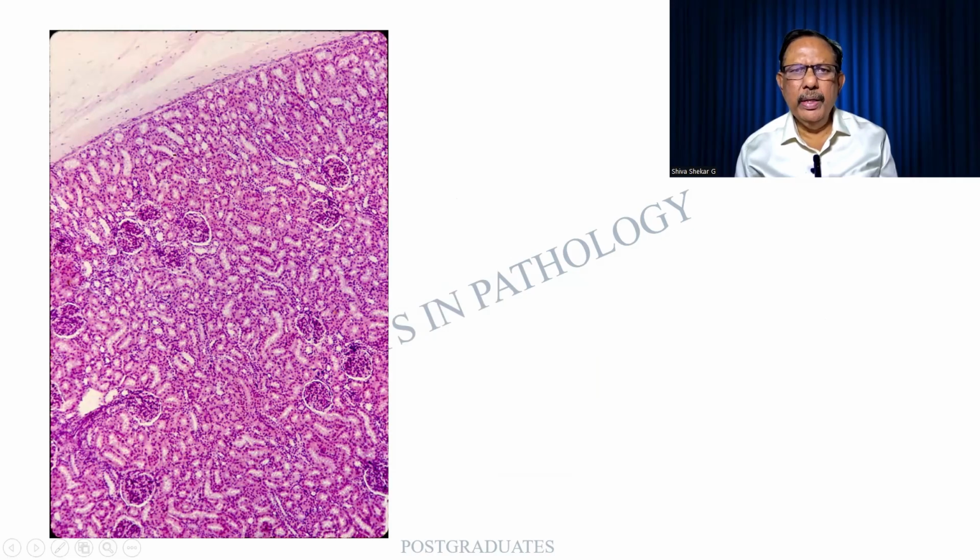You people should be familiar with it in order to explain to your students and also to understand the nuances of the renal pathology. Now forget the capsule that is there externally. I am finding multiple round structures, namely the glomeruli. In fact, the adequacy of a biopsy is determined by a minimum of 8 glomeruli, and that has to be represented.